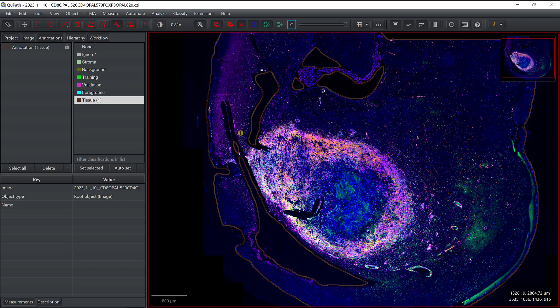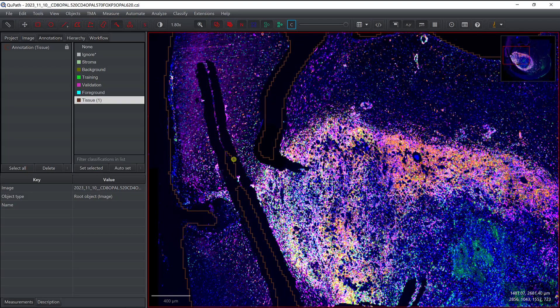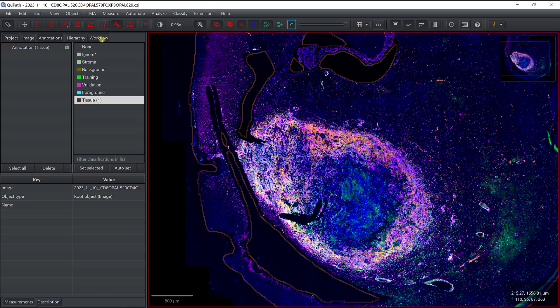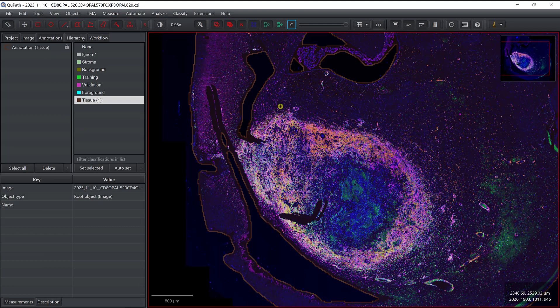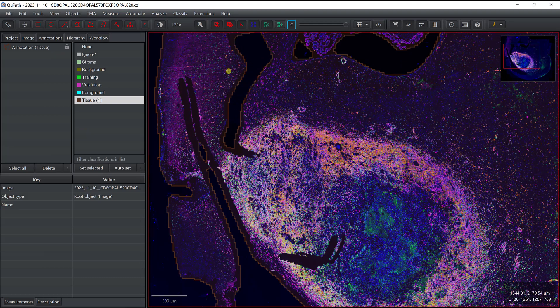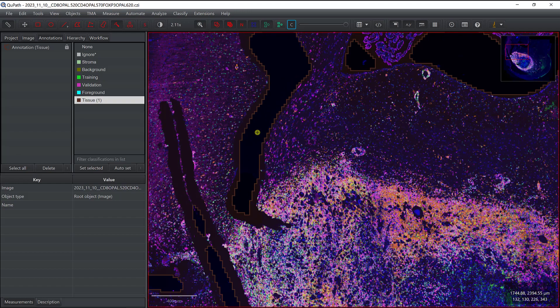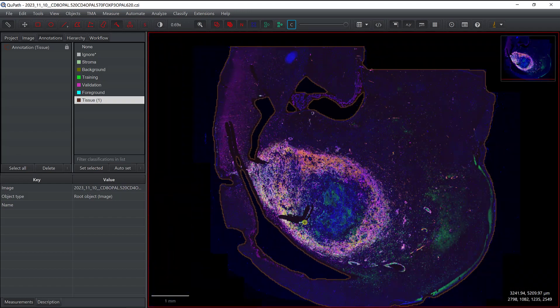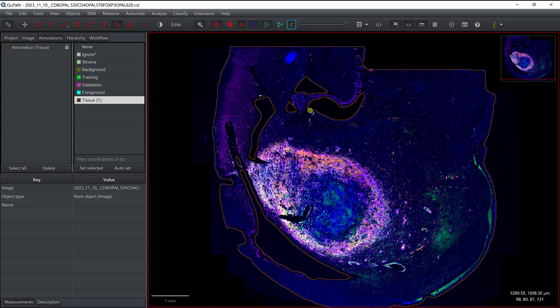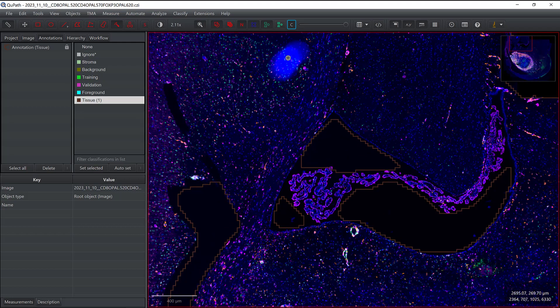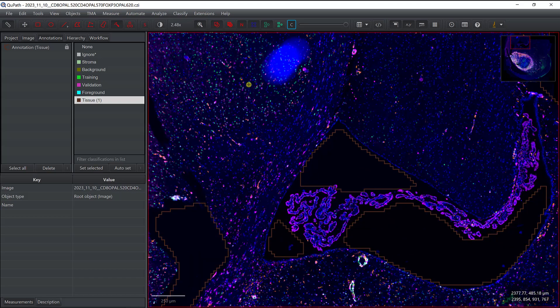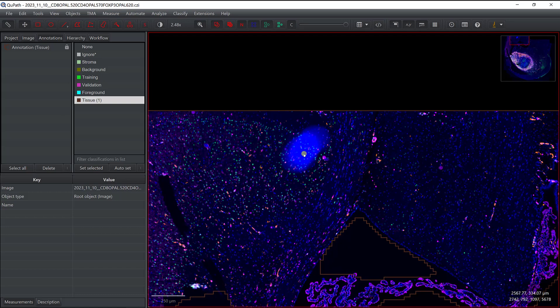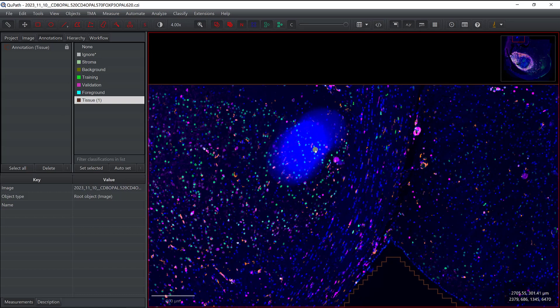The result looks pretty good. We have some regions in the background, and I can go to View and fill annotation (Shift+F) to verify. Overall it looks good. Using Shift+F I can see there was a problem from the acquisition and I probably want to remove that part. I can do that by altering my annotation.